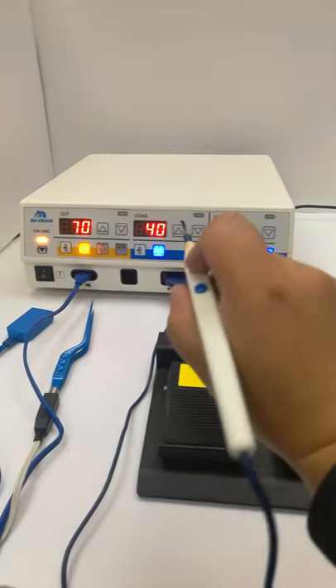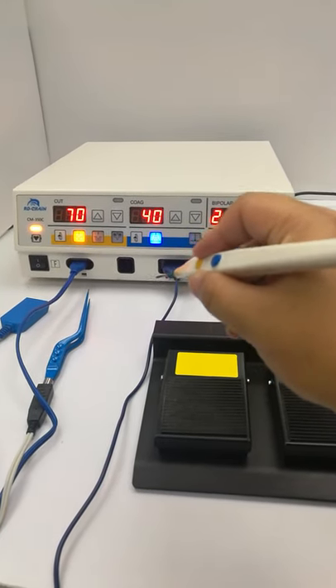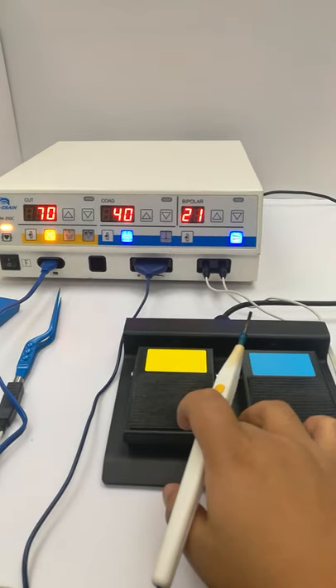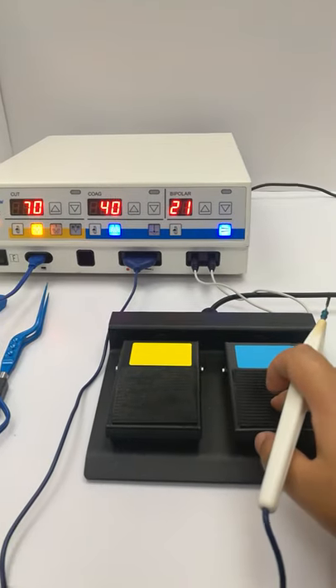You can see that this is the yellow button — it's cutting — and the blue one is coagulation, just like the foot pedal: yellow part and blue part.